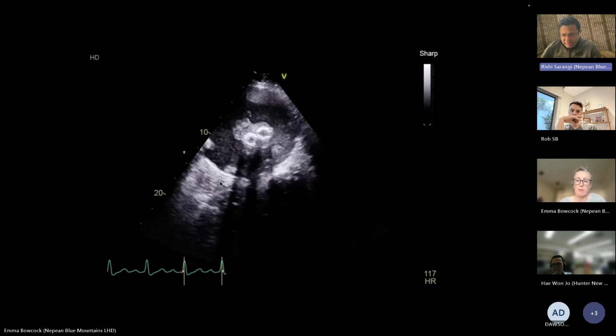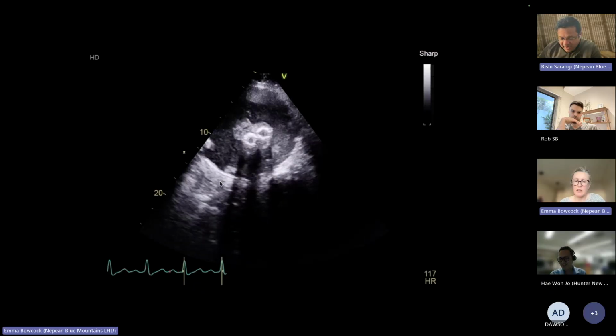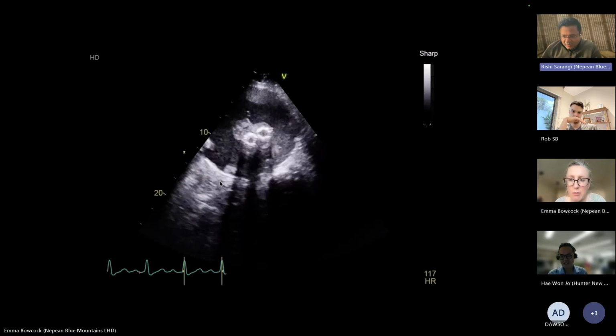So again, this appears to be some kind of prosthetic graft. I'm not sure exactly where we are looking at. This is some form of cavity or an aorta, with some graft in it. Yeah, it's the abdomen, around the umbilical region. Okay. So we're potentially looking at the central structure, a major vessel.